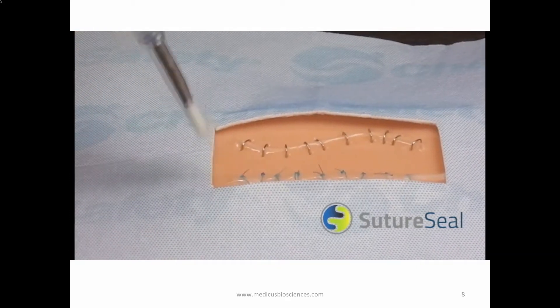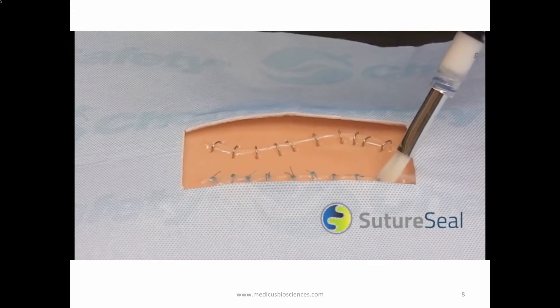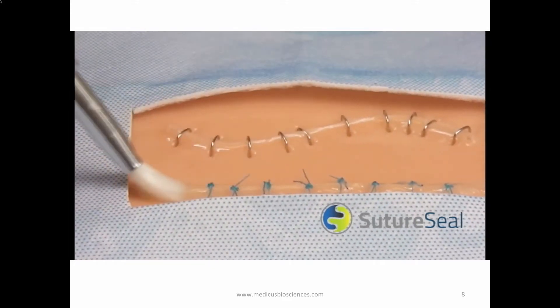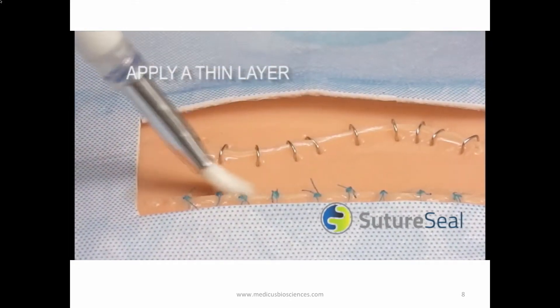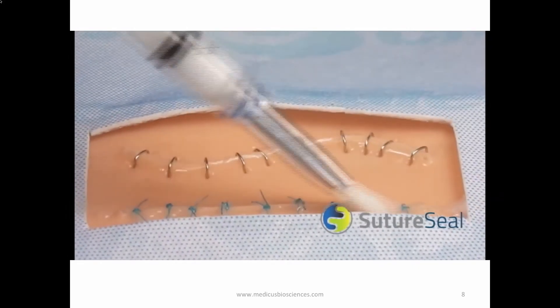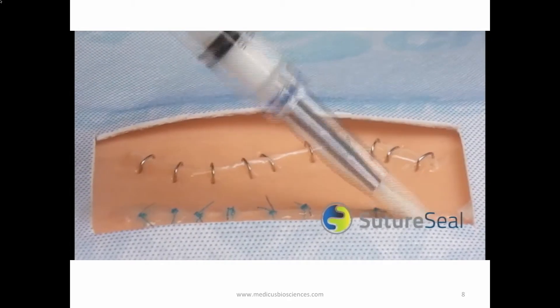Push the syringe plunger until the SutureSeal polymer dispenses from the brush tip. Brush the SutureSeal polymer over the suture line or wound area in a thin, even layer. SutureSeal is sometimes difficult to see because it is transparent or a milky white color. Run-off of excess liquid is expected.